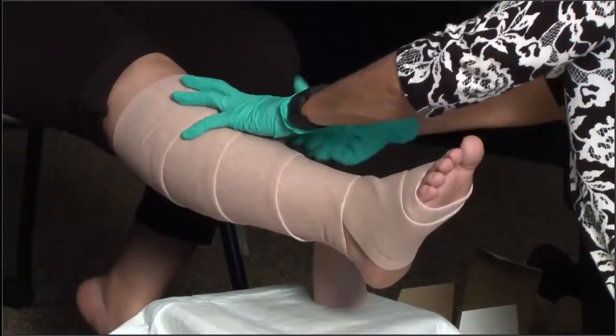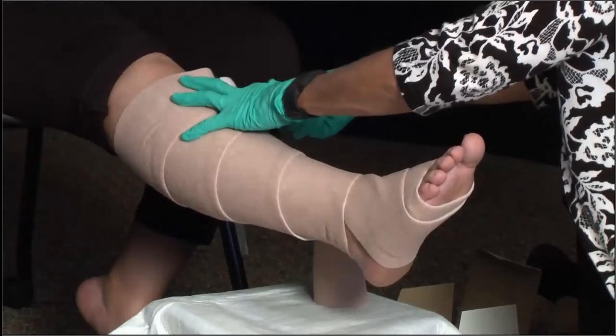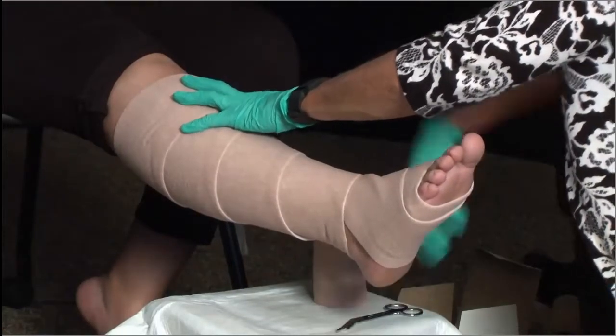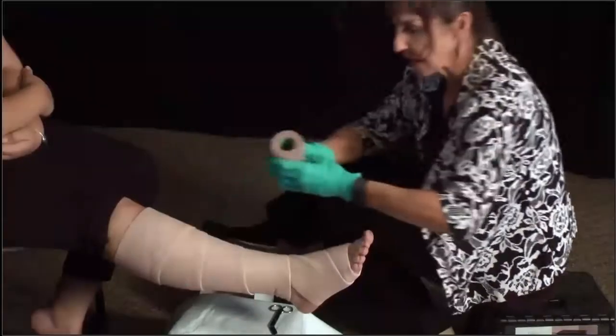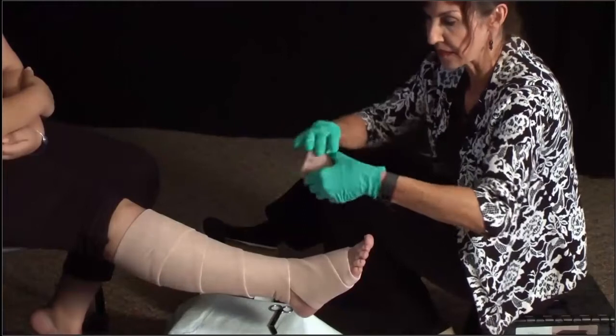I'm just going to go ahead and cut the excess roll and secure that with a little piece of tape. Then we'll go ahead and continue with our second layer.